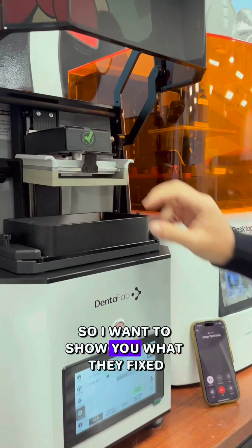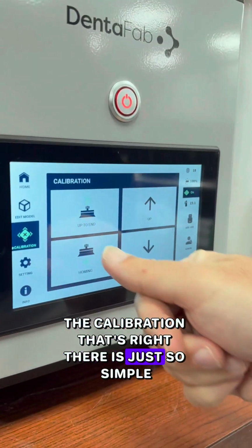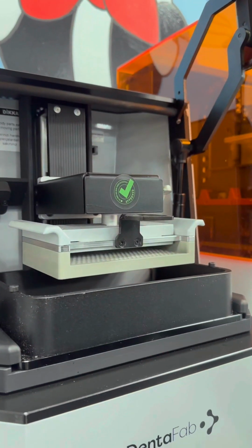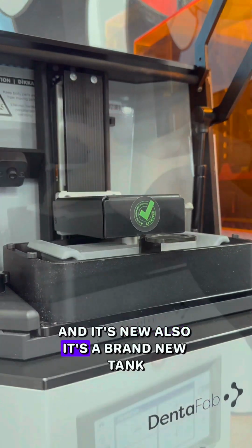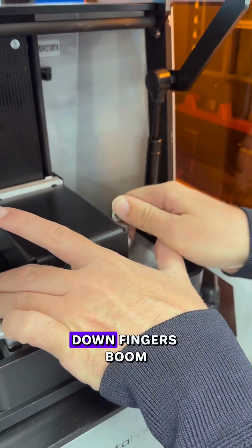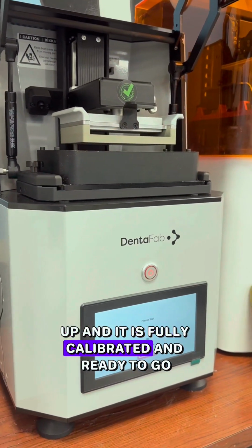So I want to show you what they fixed. The calibration that's right there is just so simple. So one little knob that you turn, push a button, come all the way down. The tank is actually empty and it's new also. It's a brand new tank, much better than the one before. Just tighten everything the way it's supposed to be. Down fingers, boom, push a button, home up. And it is fully calibrated and ready to go.